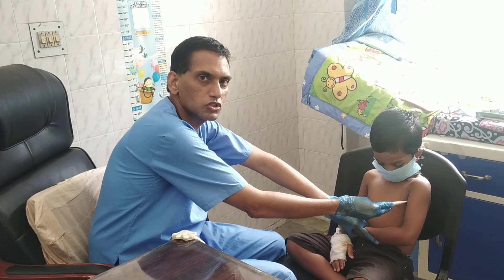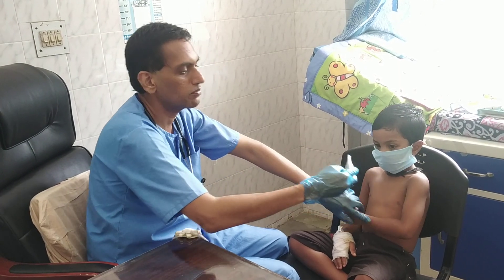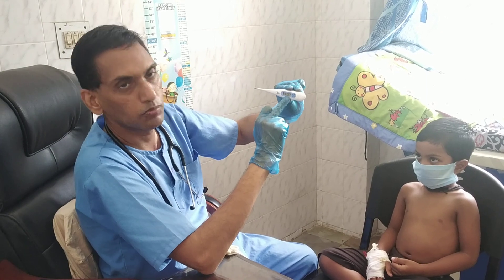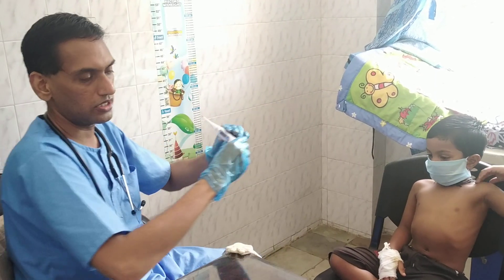You can hear a small beep which indicates that the temperature is ready to be checked now. It says here 97.2, which is completely normal for a child of this age.